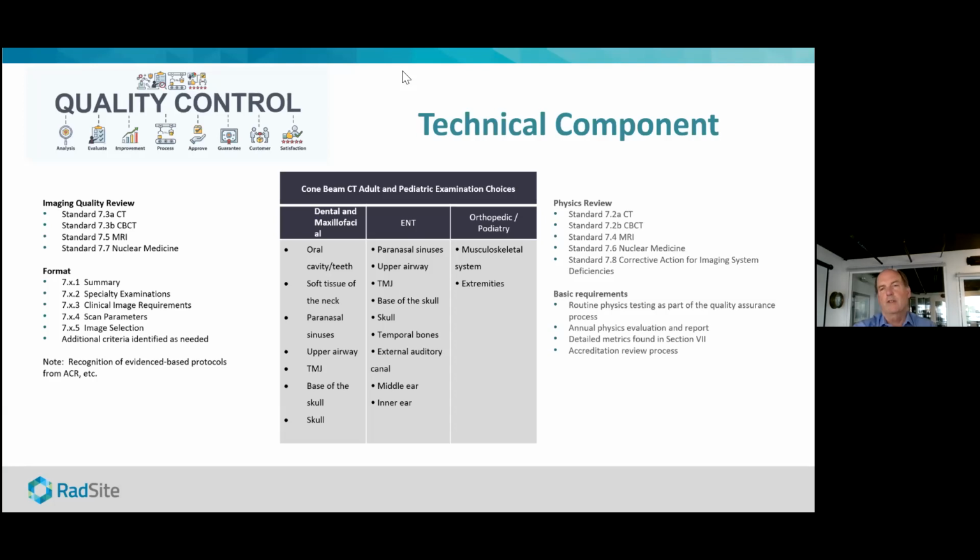And to your point, Dr. Siegel, it's really because there's not universal uniform phantoms yet in the cone beam CT space. Using the manufacturer phantoms, which you have on site, will be sufficient to meet our standards. I think one thing that's really important, Gary, is that the practitioners of cone beam CT, dentists, technologists, et cetera, feel comfortable that what they're doing with their machine is effective, high quality, and safe.